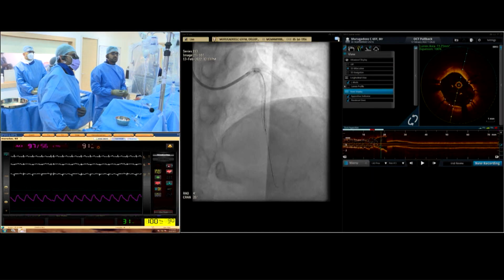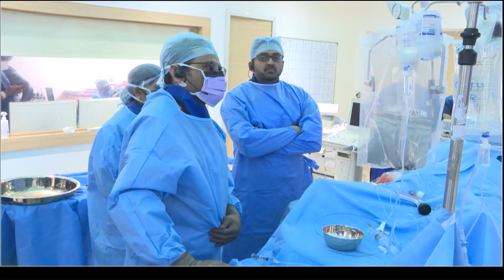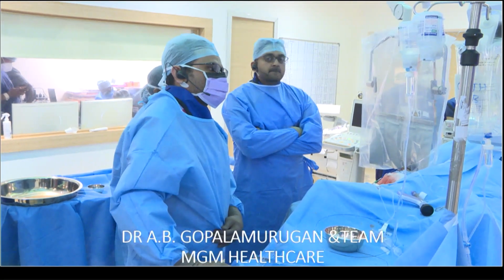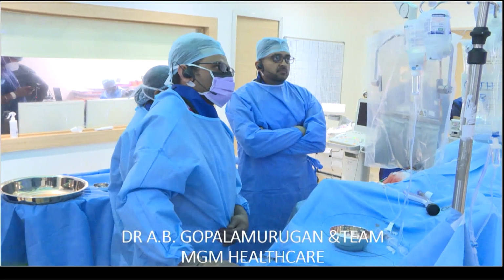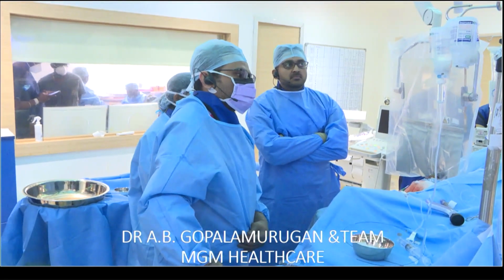Yes, yeah, Helen and Anuj comment. Absolutely. Well done, Gopalamurugan. Thank you. Actually, opening up those 2 struts which are projecting in the circumflex was really helpful.